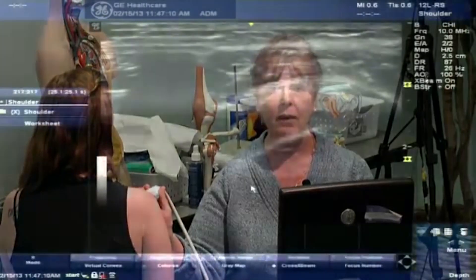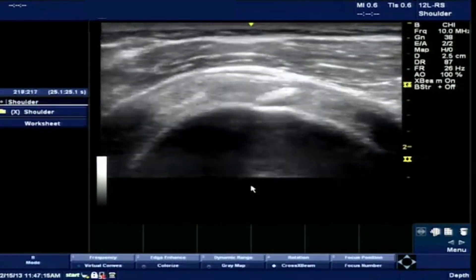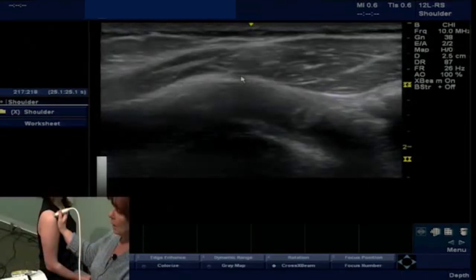Today's hot ultrasound tip is to demonstrate an alternative view to visualize the rotator cuff interval. The rotator cuff interval is a triangular shape that rests between the subscapularis tendon and the supraspinatus tendon. It's comprised of the coracohumeral ligament, the long head of the biceps tendon, and the superior glenohumeral ligament.